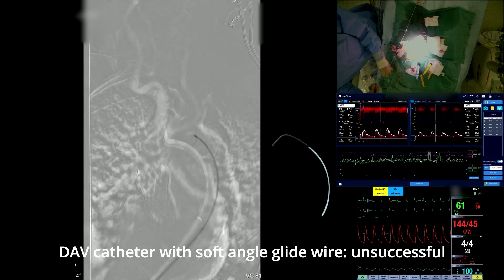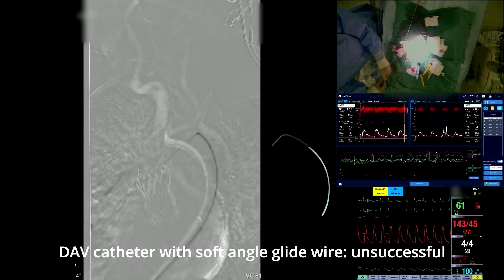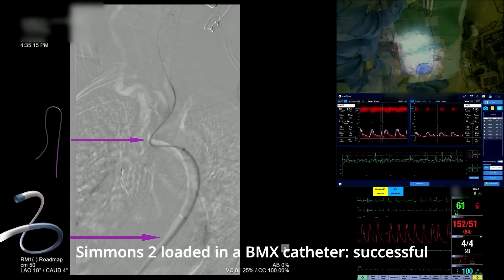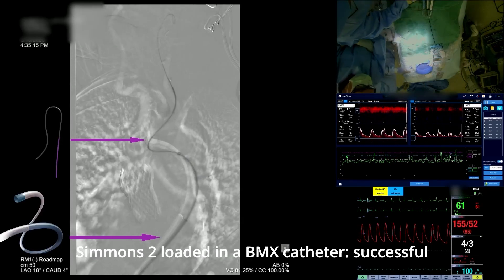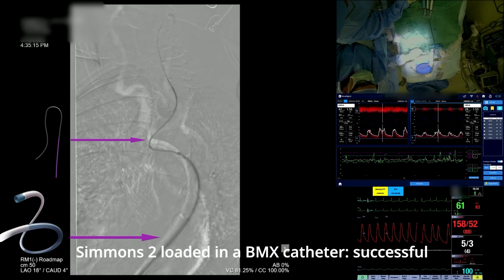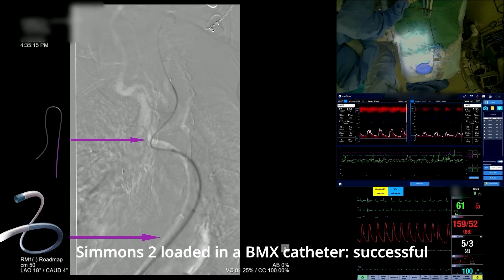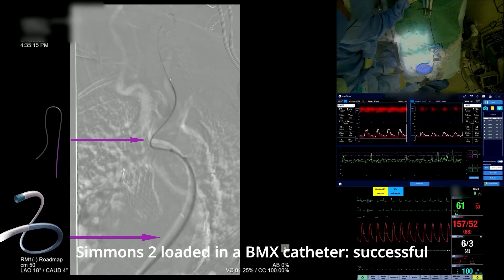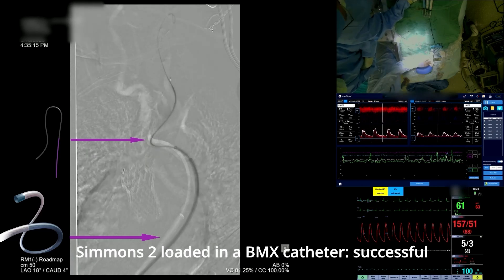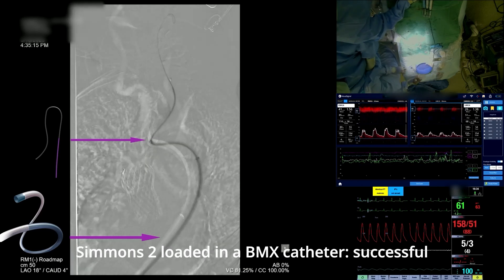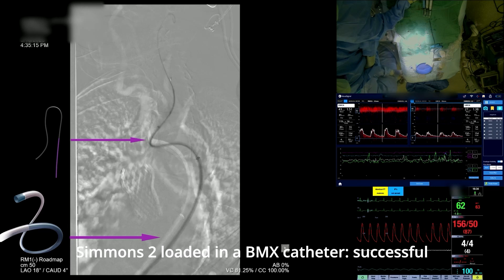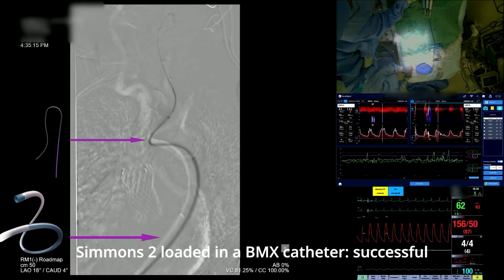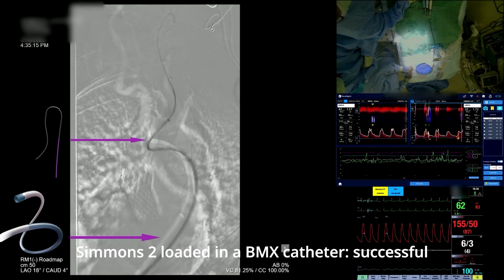At this time, the catheter was exchanged for a Simmons II, again loaded into a BMX catheter, and finally the left CCA was successfully cannulated. The TCD showed minimal embolization with no major perfusion changes.